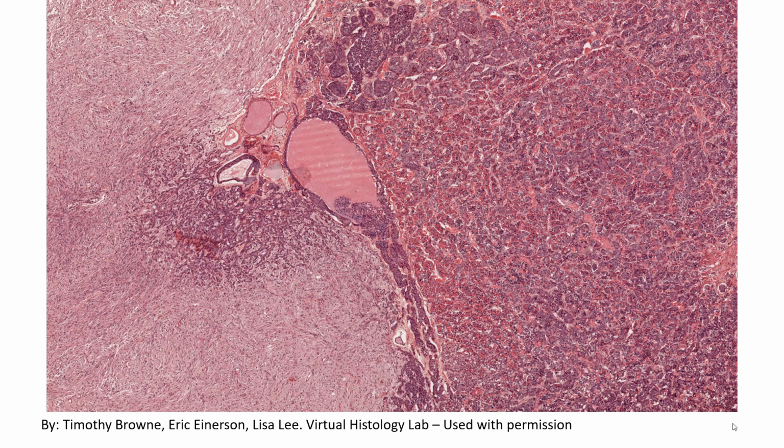So if we look at the area right smack in the middle, we see something that looks like this. So the tissue, I don't think red is a good color here, so let's switch this up to, how about bright yellow? If we draw a line on here, sometimes my pen takes a second to catch up. There we go. Everything to the right of the line I'm drawing is anterior pituitary. And then everything to the left is posterior pituitary. And you can see that they look quite different.